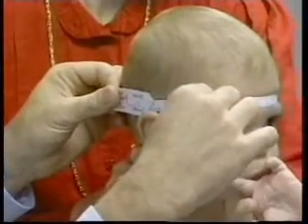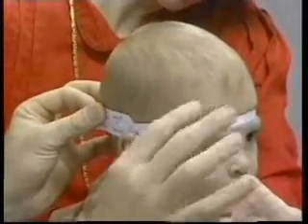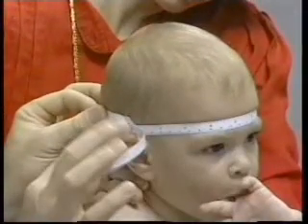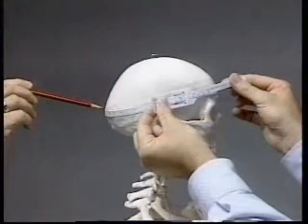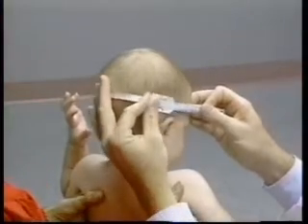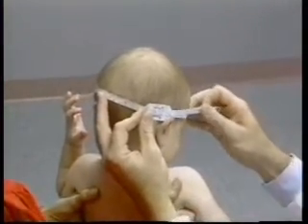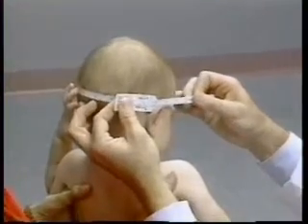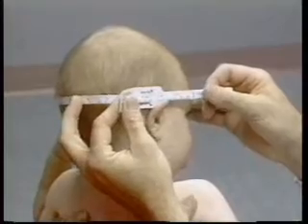The insertion tape is placed around the head. On the face, the lower margin of the measuring tape is placed just above the eyebrows. On the sides of the head, the tape extends above the ears to the back of the skull, where it is centered over the occipital prominence. While holding the tape in place over the eyebrows, the tape is moved up or down as necessary on the posterior aspect of the skull to locate the maximal circumference of the head at the occipital prominence.